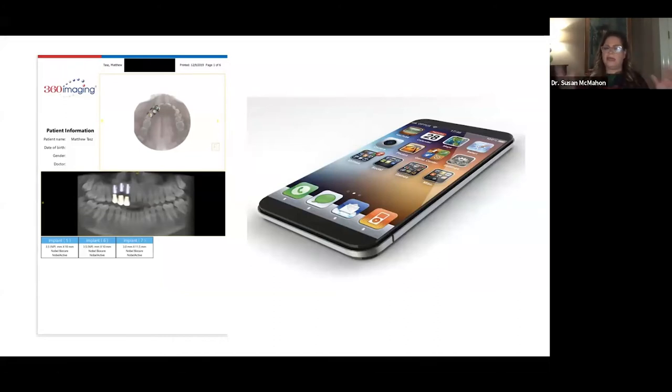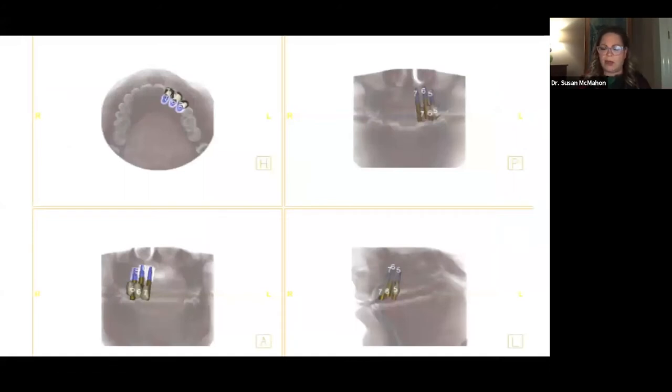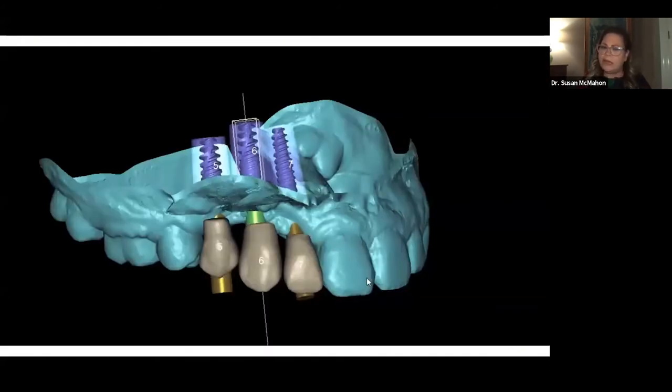And this is all happening 15 minutes after he's left, or sometimes while he's still in the chair, we can make this happen. So we're examining where we want these implants, what's the best case scenario. We know what brand we're going to use. We're looking at it all the different ways and we're marrying it with that iTero scan. So I know where I want those restorations to be from a smile design standpoint and from a functional standpoint with that class 3 occlusion.